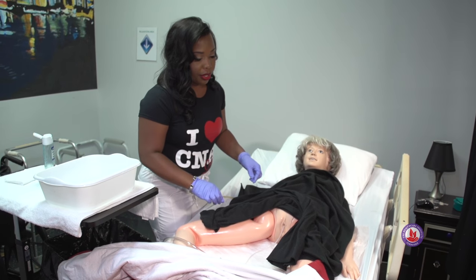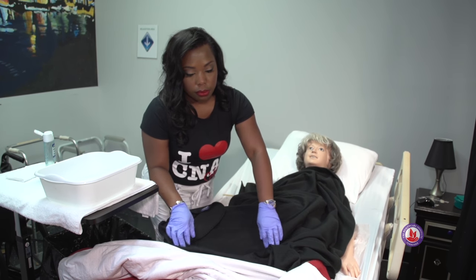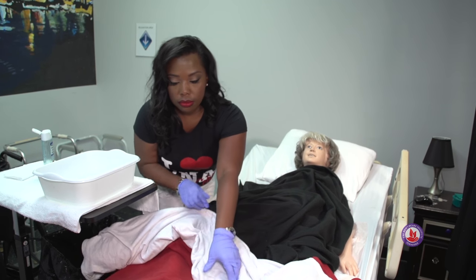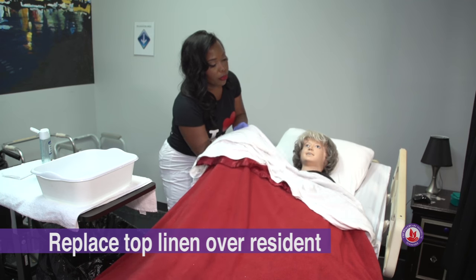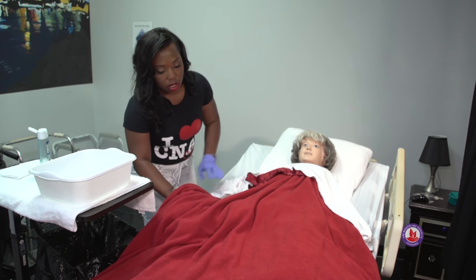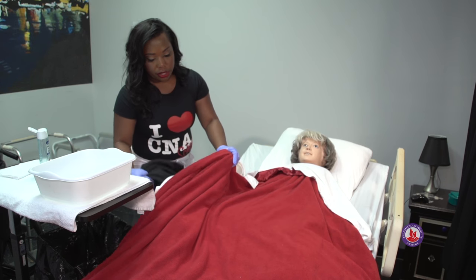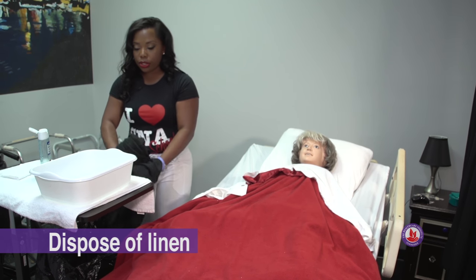At this point you're done with your catheter care. Pull the covers back up, and then remove the privacy blanket under the cover to maintain dignity and respect for your patient. Be careful not to touch your uniform. This goes into your linen basket.